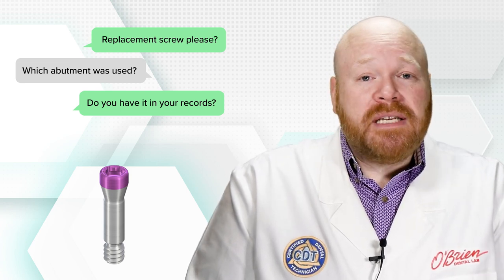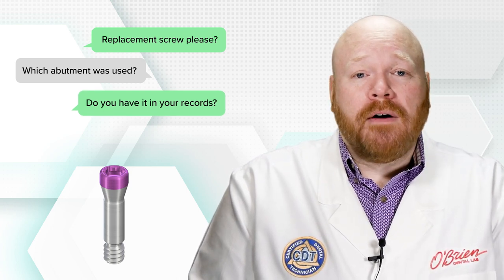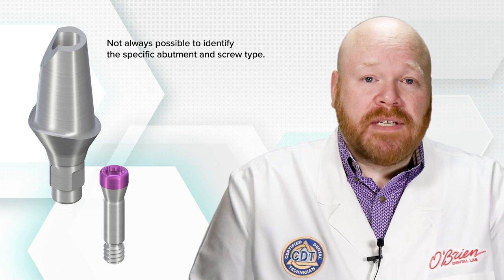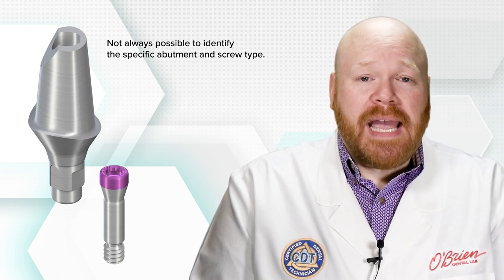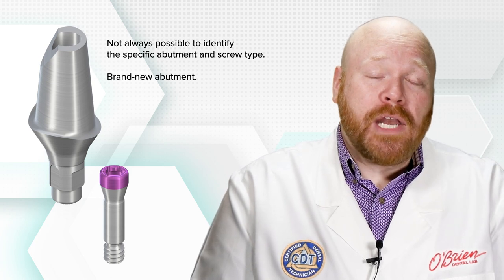The other option is to try to have your current lab identify the abutment and screw for you. This usually involves removing the abutment and sending both it and the screw to the lab for evaluation. If it's not possible to identify the specific abutment and screw type, you'll most likely have to start over with a brand new abutment.